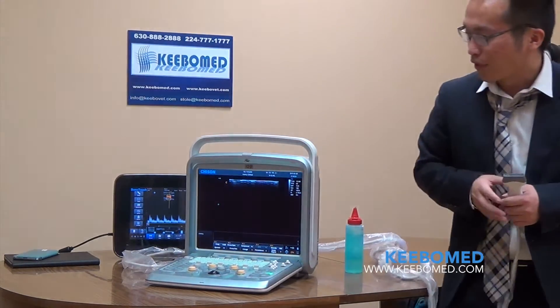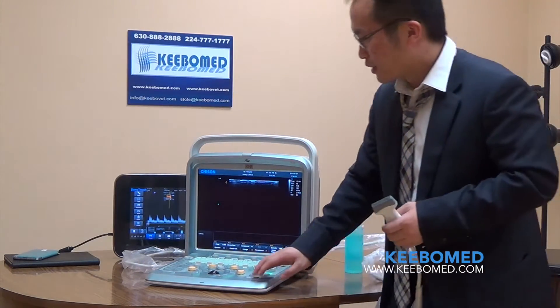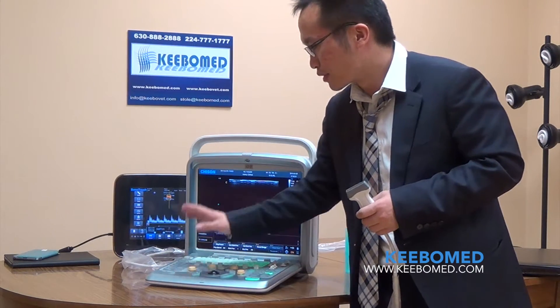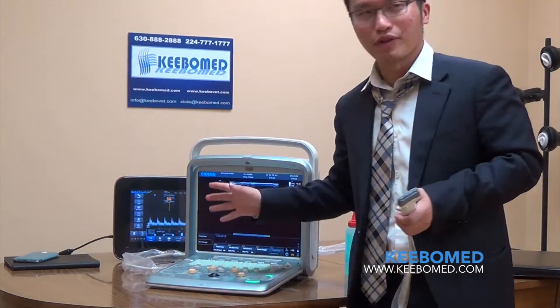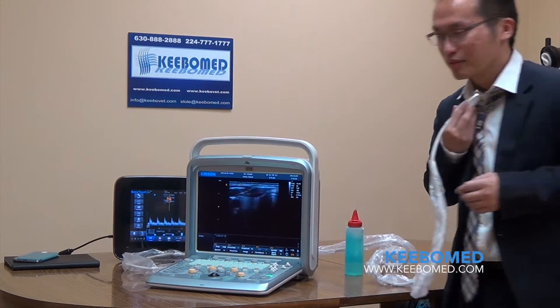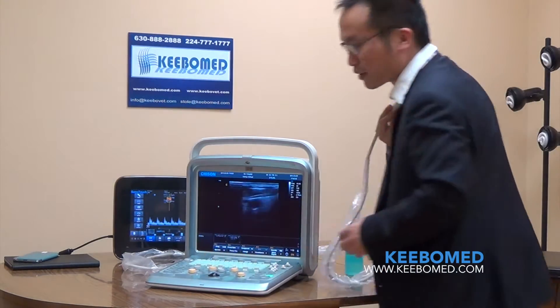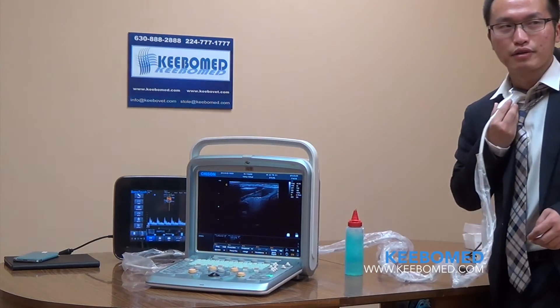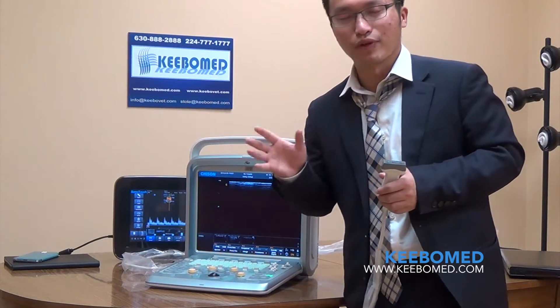For our system, we also have one key save. When you freeze, you can press a button to save images or save cine memories. Most companies can do this, but our system can also save images in real time — just press it while it's live and save the image or cine memory. This saves a lot of time for doctors.